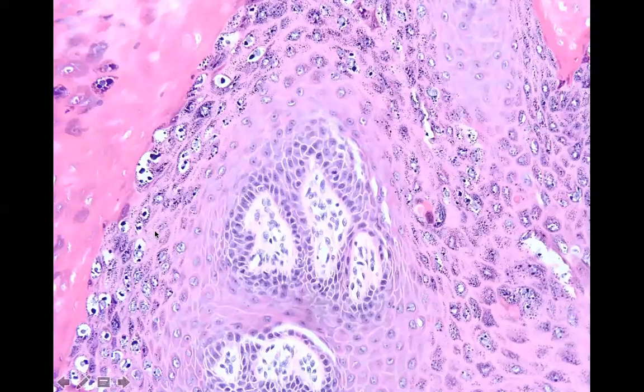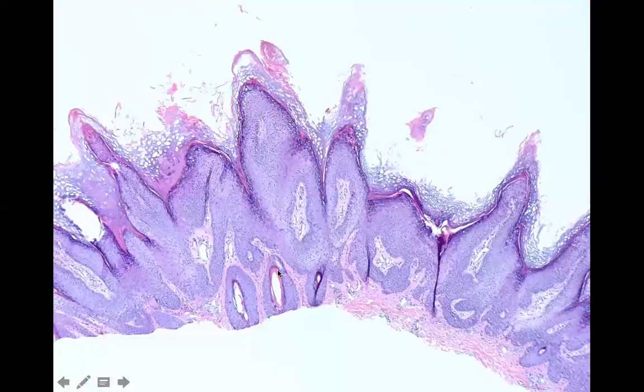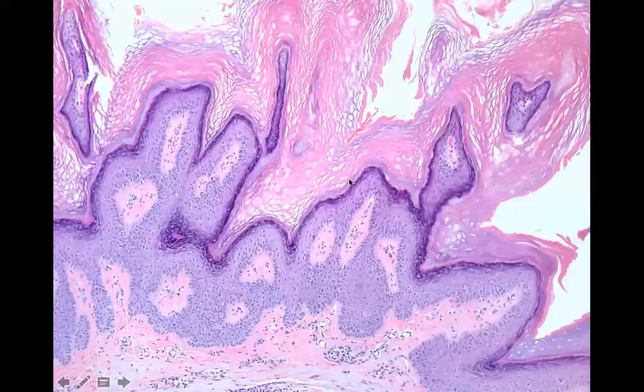Okay, so look in here. This is a koilocyte, right? You have little viral particles, you have kind of clumpy keratohyalin granules, and you have these white spaces. This is koilocytic change. You see this in kids because their warts tend to be fresh. You might see it in an immunocompromised or an older patient. But usually like a regular adult, you don't see a lot of really, really fresh warts because their immune systems have started to recognize it. Here's another wart, digitated, little hand-holdy, nice koilocytes, active wart. This is an old wart, okay? We don't see as much of the epidermal hyperplasia.